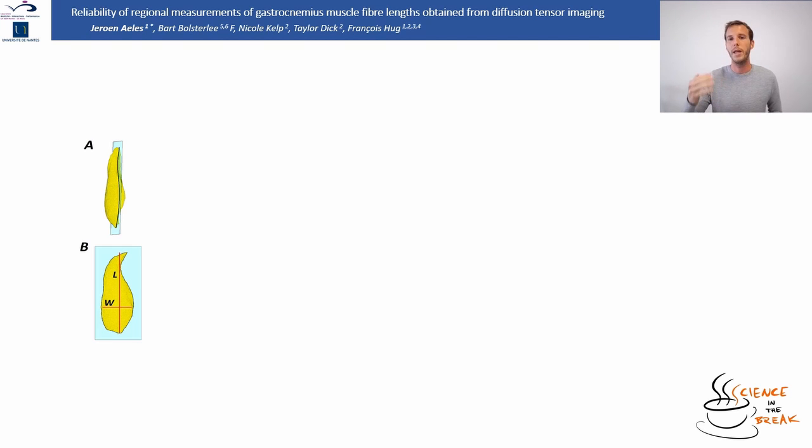So basically we go through each of the slices on the MRI and we highlight which muscle we're interested in. Then we stitch this all together and we get a nice example like we can see in here. And I've got this video here. I'm just going to rotate the muscle around a little bit just to get you a good idea of what you're actually looking at.